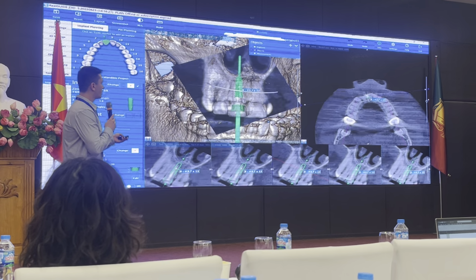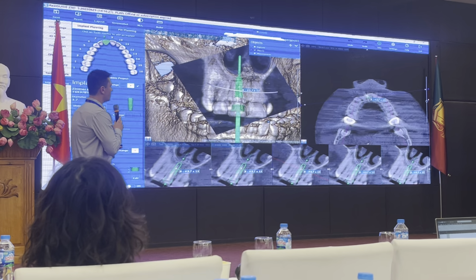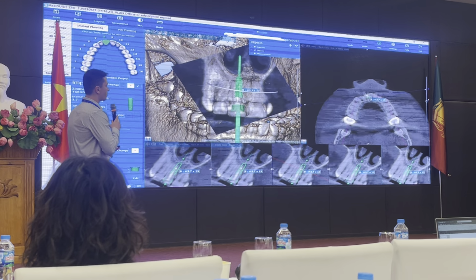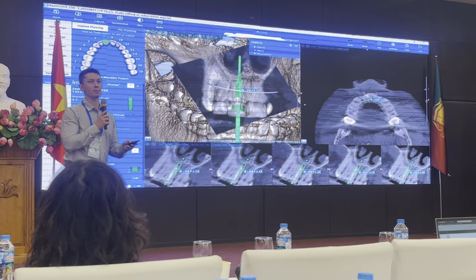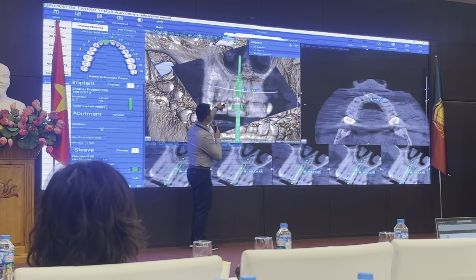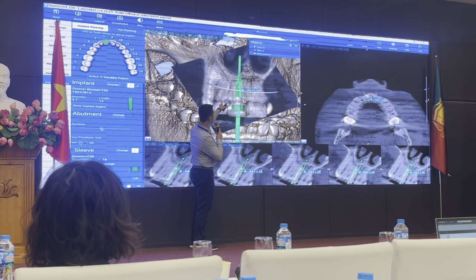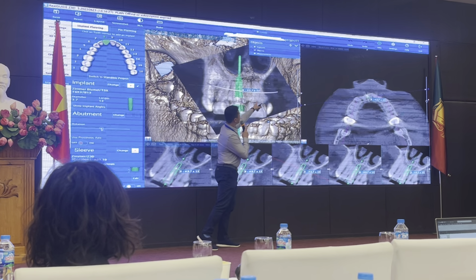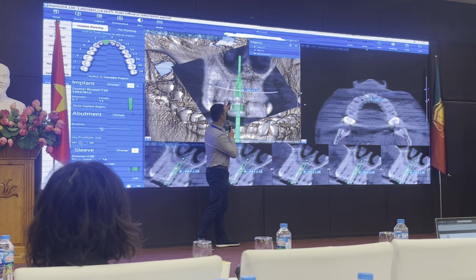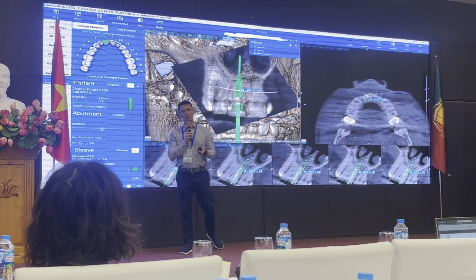With the research that Dr. Tarnow has discovered, we can evaluate the mid-facial gingival margin of the adjacent teeth and measure 3 to 4 millimeters apical to that imaginary line that you draw. Let's say this is the gingival margin of this lateral, and you connect a dot from this position to that position, the gingival margin of the adjacent teeth, in an otherwise healthy periodontal patient, meaning no horizontal bone loss.